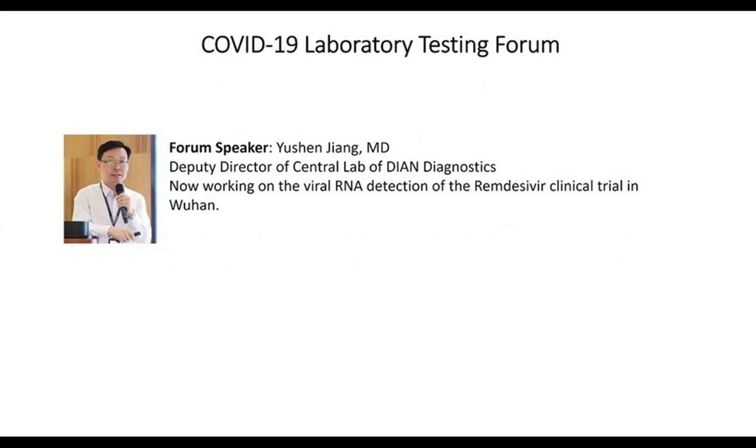The clinical and the infection characters may be changed because of some important mutations. And at this time, maybe we need to use NGS to investigate the variation of the virus. But I don't think NGS can play an important role in daily detection of virus because, as you all know, the operation steps are too complicated and take too long, and it has a high cost.